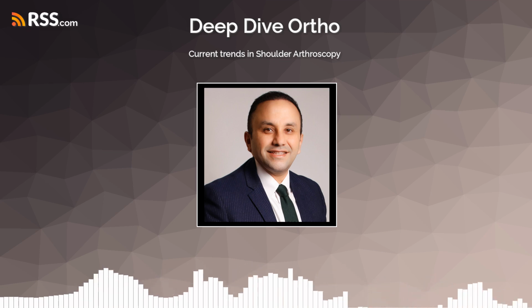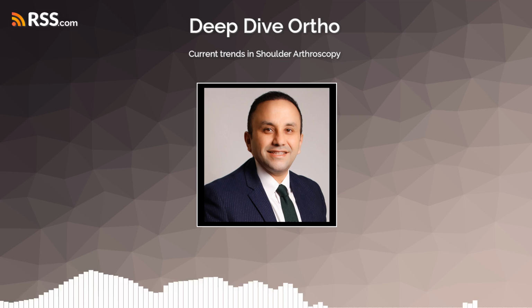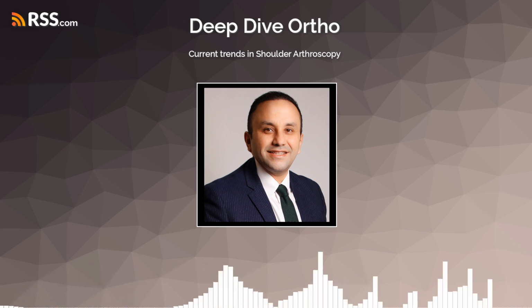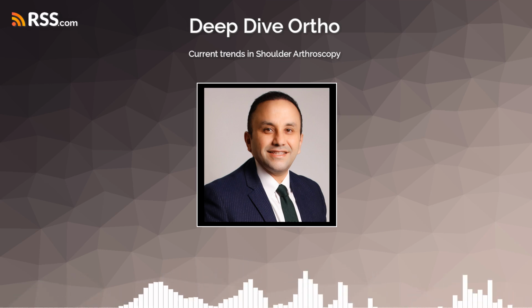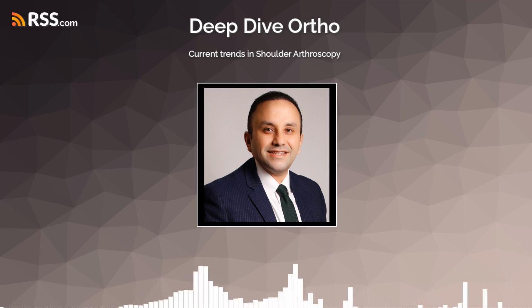Sadly, not all rotator cuff tears are repairable. What are the options when a tear is just too big or retracted, deemed irreparable? That's a tough situation. For massive rotator cuff tears that can't be repaired directly back to the bone, there are several surgical and non-surgical management options. Like what? A subacromial balloon spacer can be inserted arthroscopically. This is like a temporary inflatable cushion placed between the humeral head and the acromion.